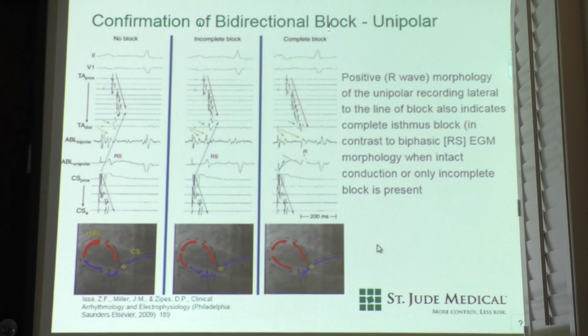Intracardiacs? That's probably the first time you've seen intracardiac electrograms, maybe. Right? These are made using little bitty antennas. You understand when I'm talking about an antenna, basically. An antenna is just a positive and a negative electrode separated by some space. That is all an antenna is. And so when you apply voltage across that, this is kind of electromagnetic theory a little bit, but anytime an electromagnetic wave travels through that and hits one before the other, you get a change in the voltage. That's how an antenna works.